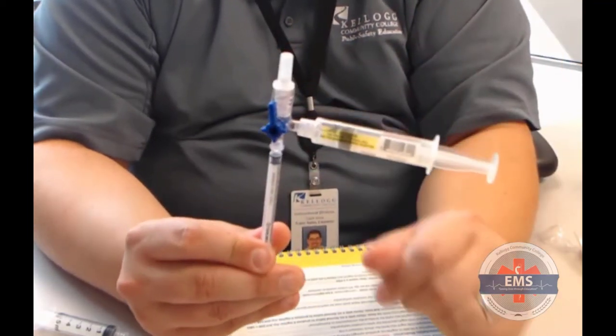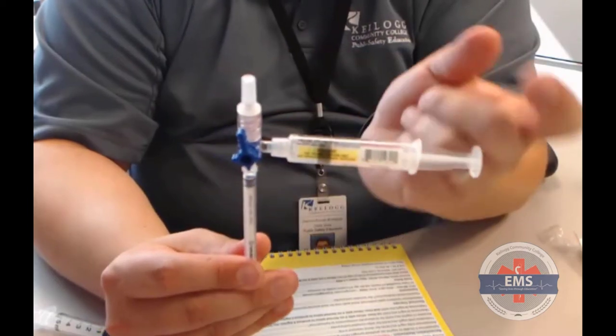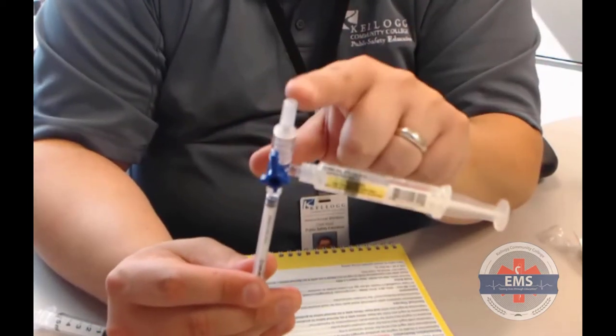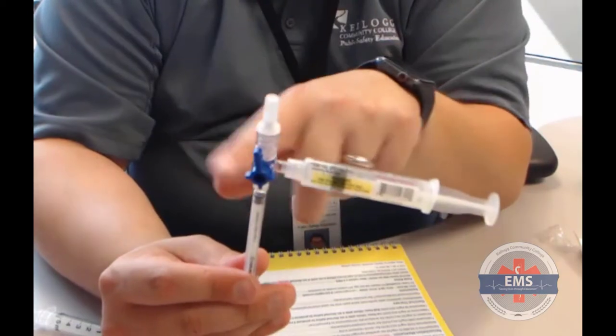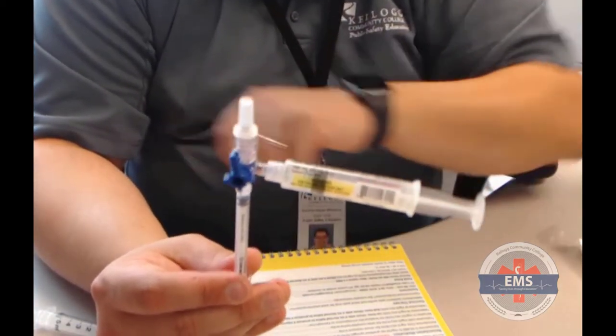It's relatively simple to do. It's a very good controlled way to do it, but you have to make sure you understand how to use the stopcock. If you have a stopcock which has extension tubing off the end of it, that's fine. You're only really using this 90-degree port here, so that's not too big of a deal.